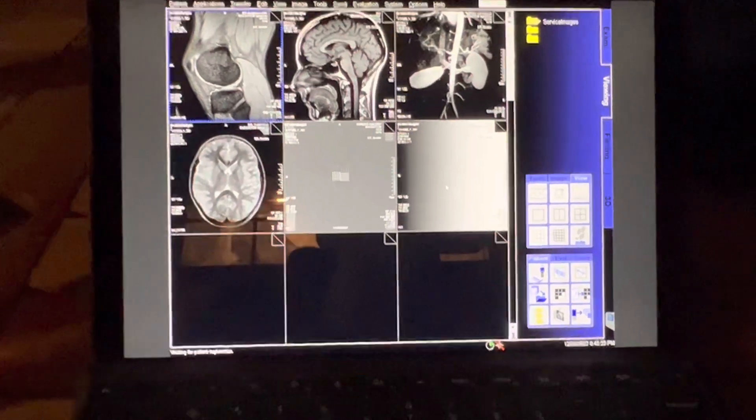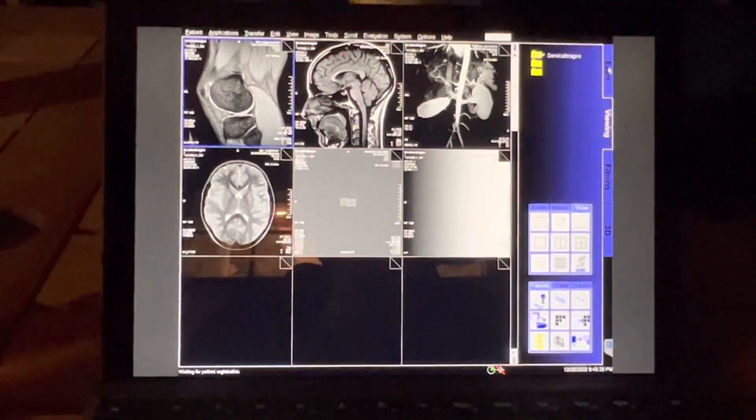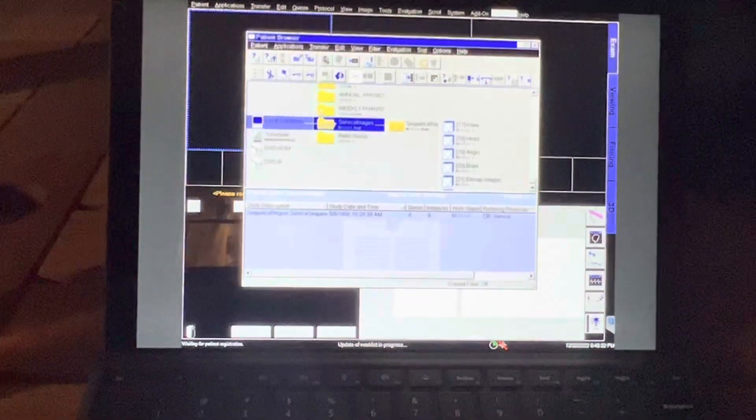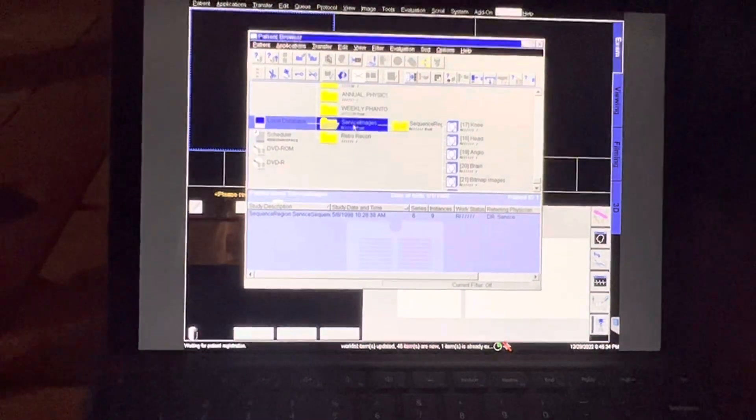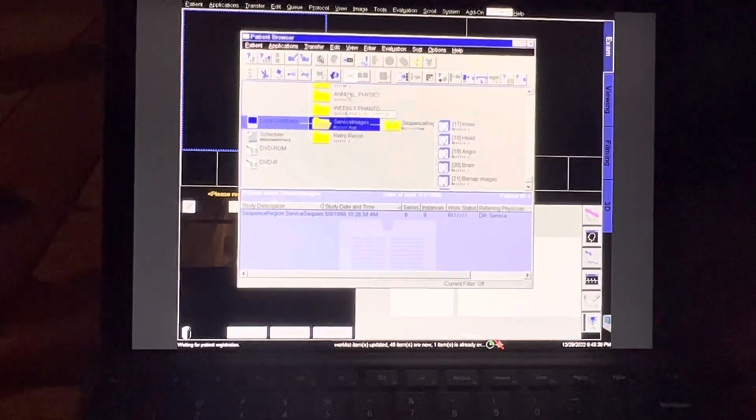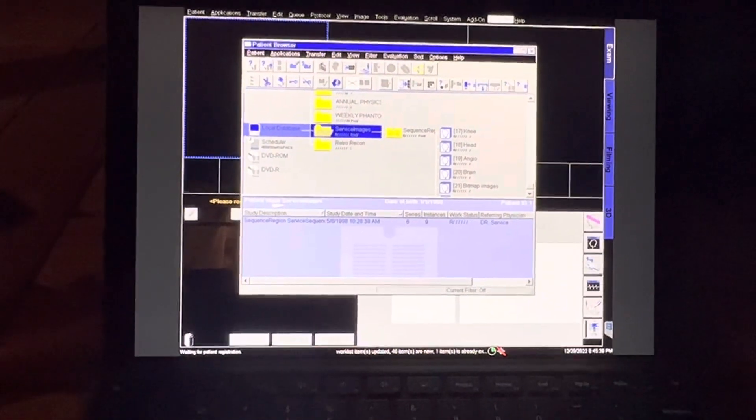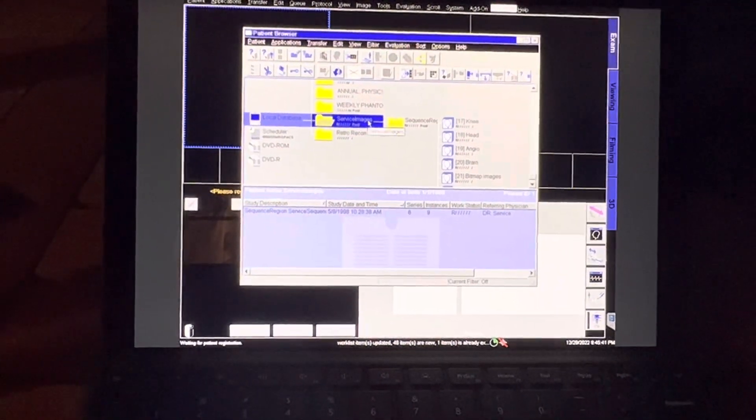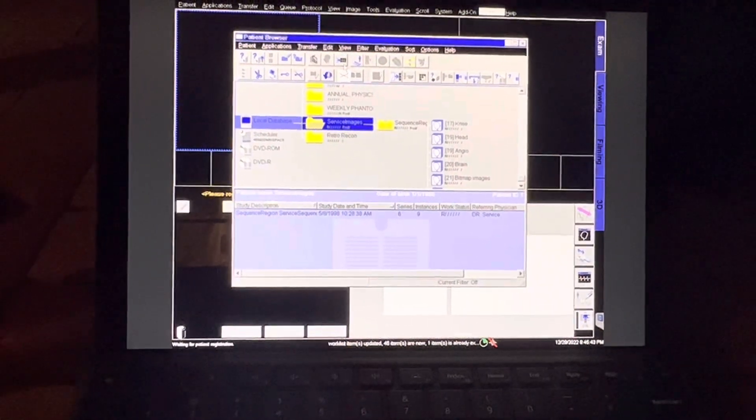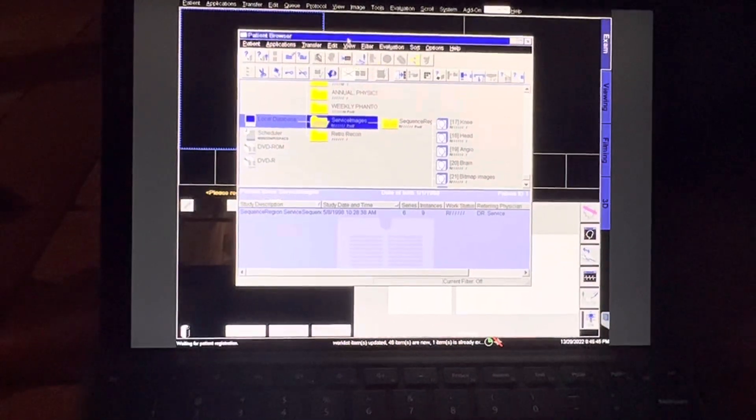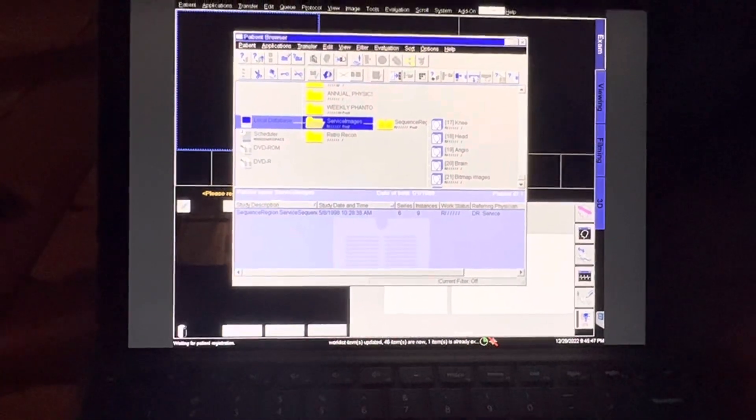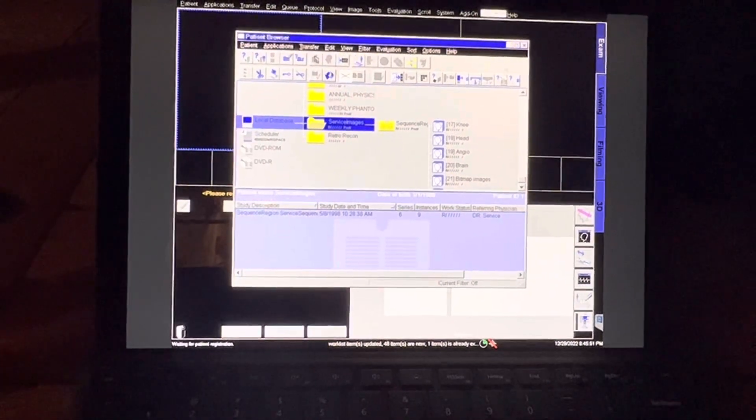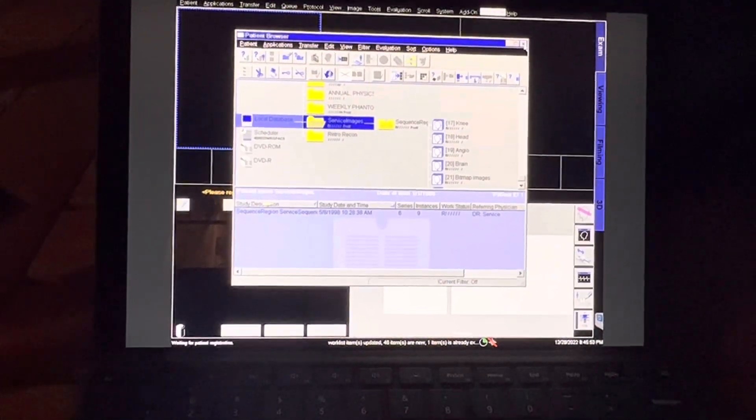So again, if we go to the exam card, Patient Browser, and I'm using the Service Images because you can see that there's no patient data here. If we click on this one and then highlight under the View card here, if we hover 'Load to Viewing,' that will load them all into viewing.